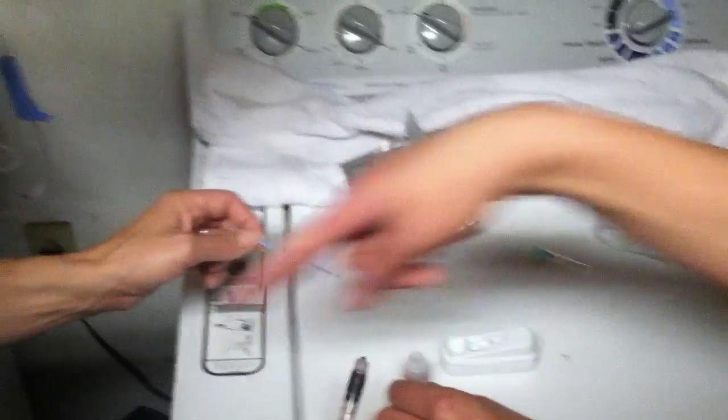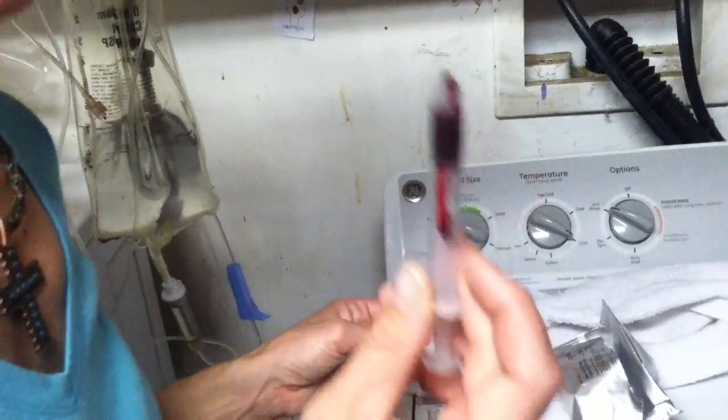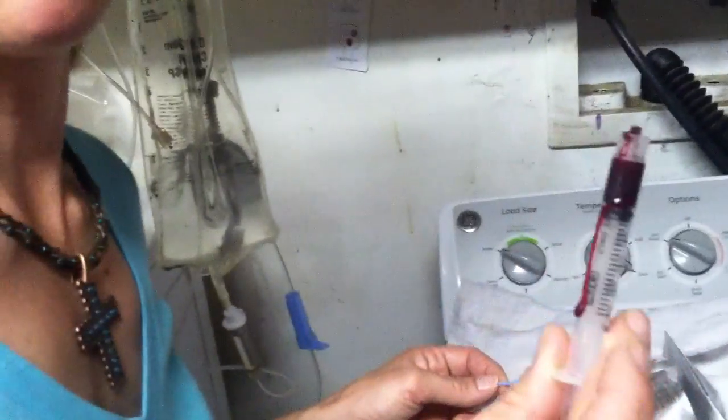All right, now you're done with your blood, so you can throw your blood away. Wow, I overdrew a lot of blood. That poor little foal donated way more than necessary. All right, and you're done with your wand — shake that about 10 times or so.